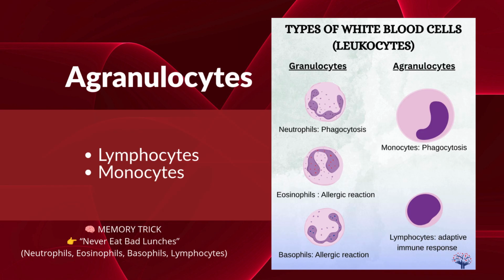Consider also the cytoplasm, whether there's a high nucleus to cytoplasm ratio or a steadier ratio. Here's a memory trick: reactive lymphs react and blasts invade.